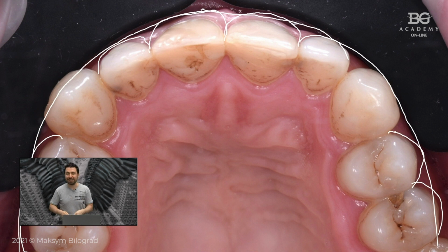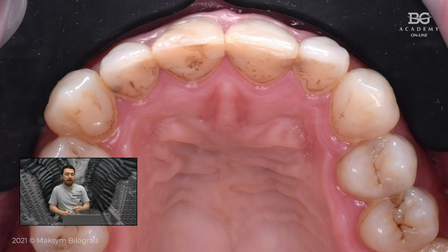We can actually test this by the mock-up. We can ask our dental technician to do the wax-up, then we transfer this wax-up into the patient's mouth with the mock-up, and we see how much we add, and we see if the teeth are, let's say, over-contoured or normal contoured, and so on. We can get a lot of information out of the planning.